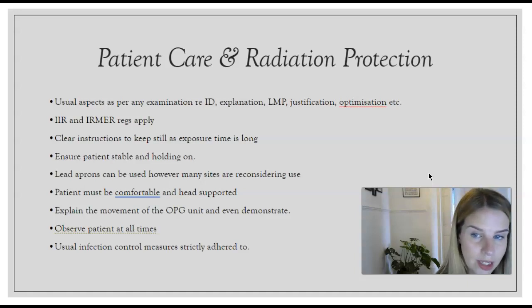So ensure the patient is stable. If they're not stable and you don't feel that they're able to do the x-ray, then obviously you'd have to speak to the referring clinician about that. You can still use lead, although I know that some sites are reconsidering the use of lead, so just use it in line with your site's protocols.